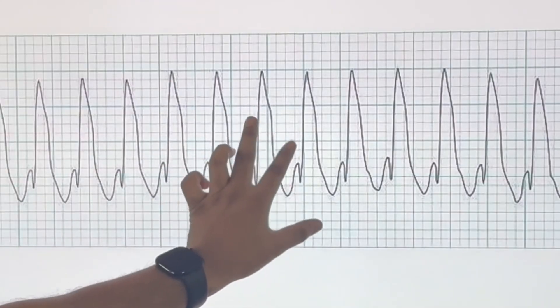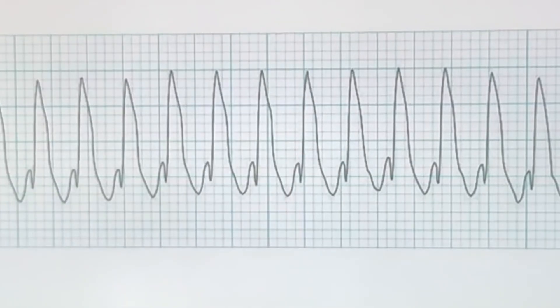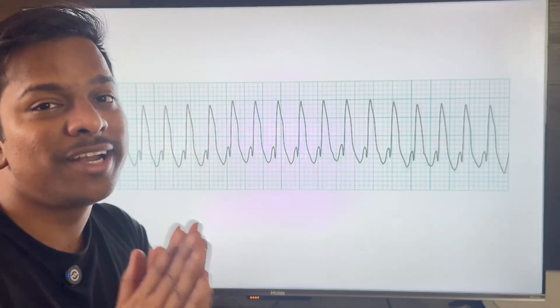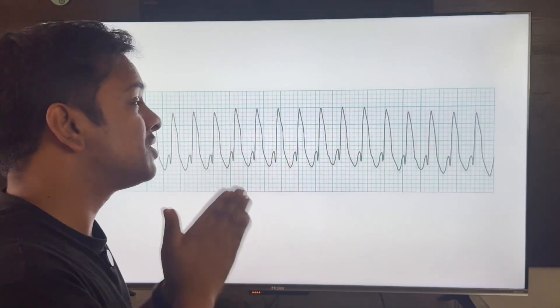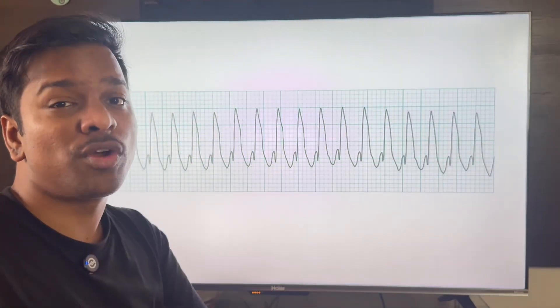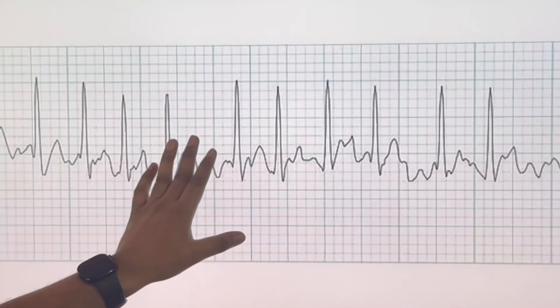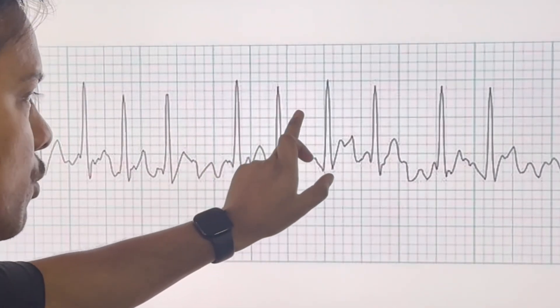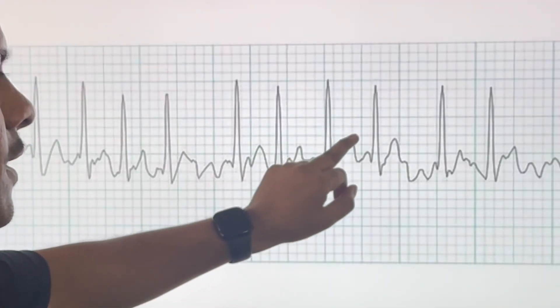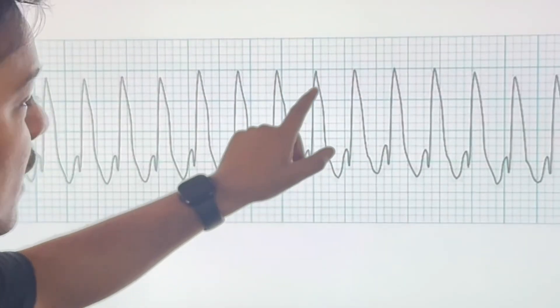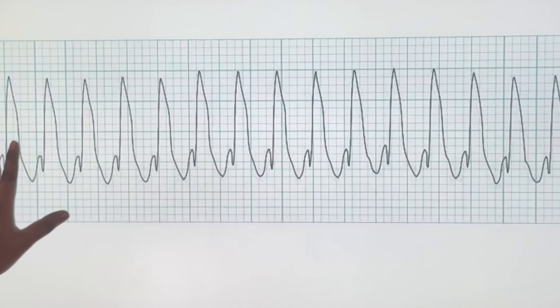Next, we have a broad QRS complex tachycardia with a heart rate close to 300. The important differential diagnosis for this is ventricular tachycardia. The patient most often has a history of ischemic heart disease. Note that in supraventricular tachycardia the QRS is narrow, but in ventricular tachycardia the QRS is broad.